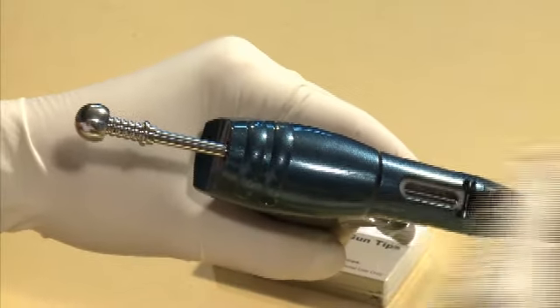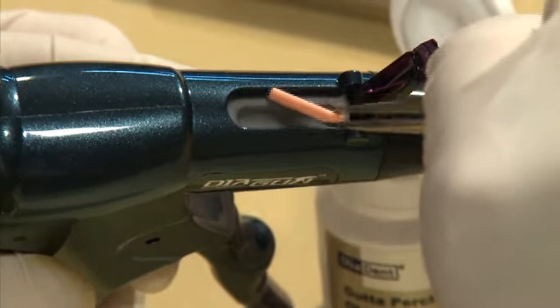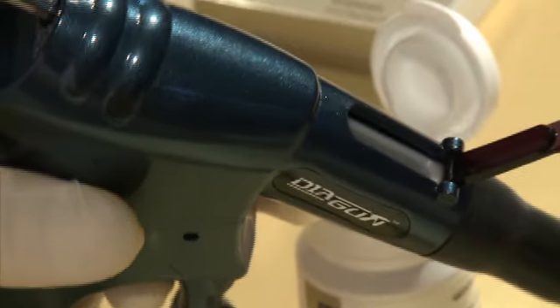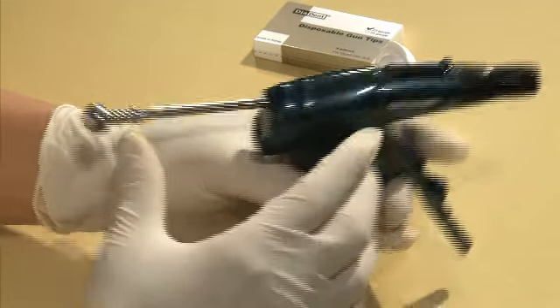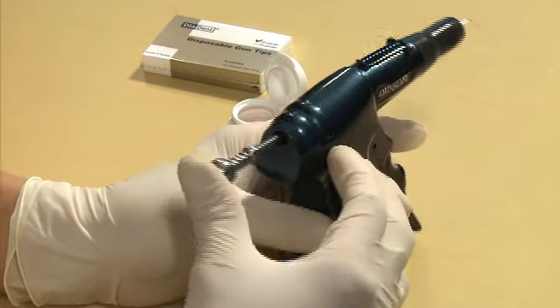Open the loading slot and pull the plunger back. Insert one Gutta Percha pellet into the loading slot — inserting more than one pellet may damage the system. Close the loading slot cover and push the inserted Gutta Percha obturator into the heat chamber using the plunger.